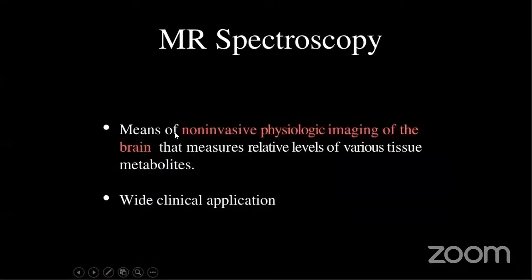MRS, just touching upon MRS, we do not have much. MRS does not add on to any information that our normal sequences give, but it is helpful in cases of tumors to differentiate the grades of tumors and all that. I just want you all to remember the normal metabolites. That's all. Okay.